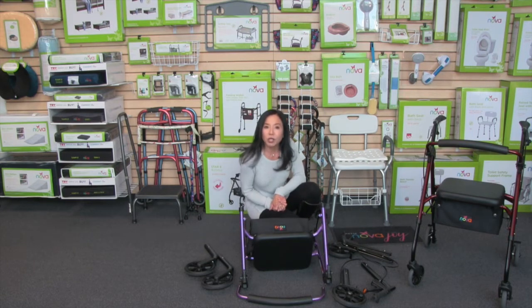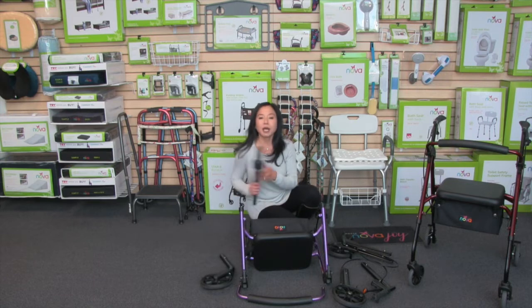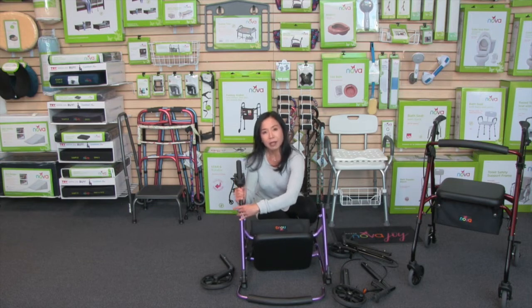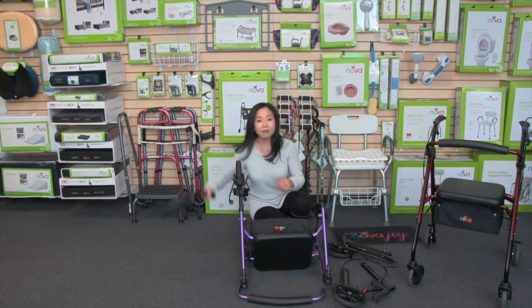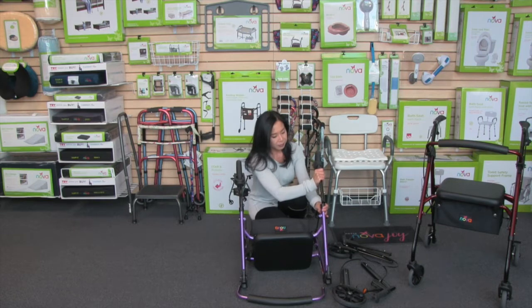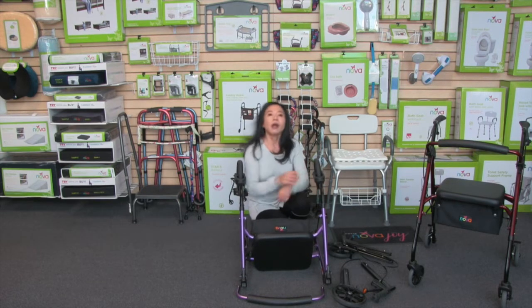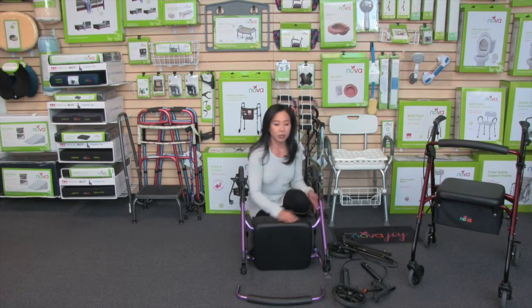All right, let's start with the front wheels. Everything comes together with these push buttons. So you're going to insert, push the button, and it's going to lock into place. And same thing for the other side. All right, now you're going to turn the frame over.